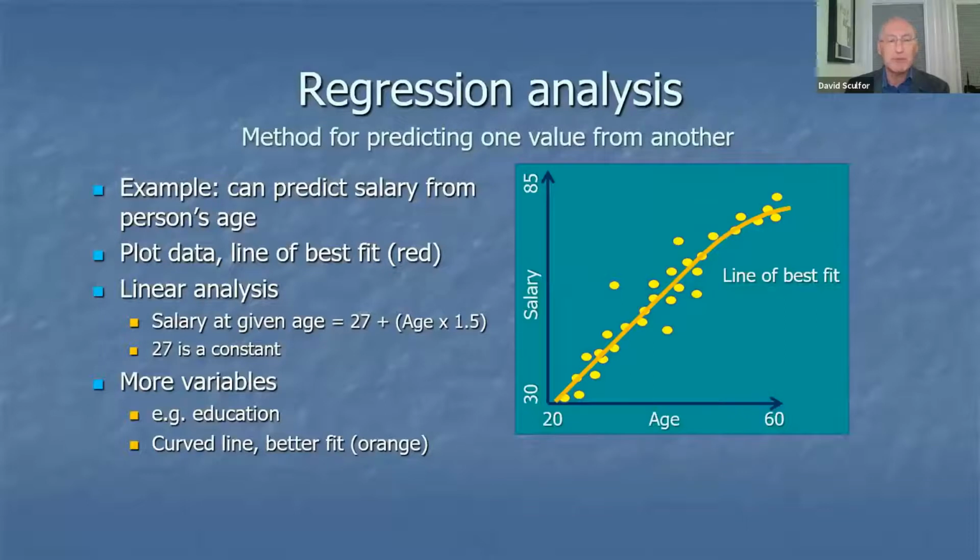And this illustrates an important point in biometry, that really all the techniques that we use for calculating lenses will have a similar sort of effect. You will still get outliers. All you're doing is getting a good predicted fit to the data, but there will always be outliers. It will never ever be 100%. And it's important to tell your patients about the limitations. I always explain to them we are aiming for a zero prescription at the end of it, but this is not an exact science. So these calculations and measurements will never be 100% accurate.